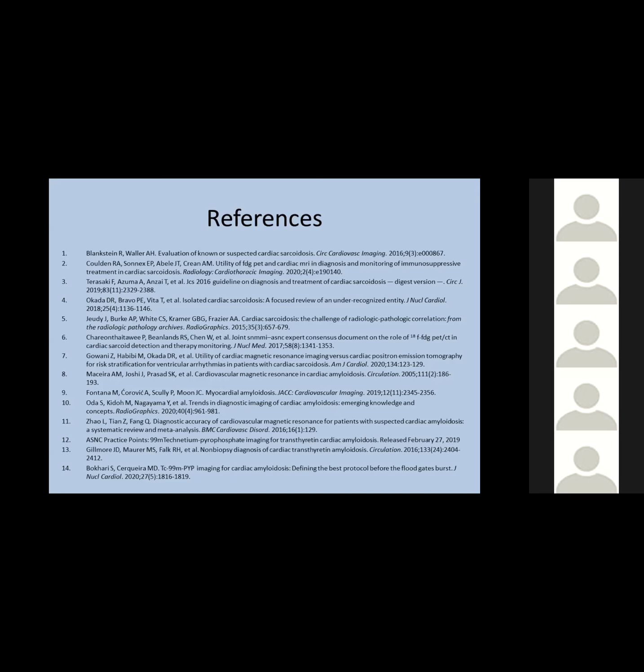Okay, yeah, so the first question, how accurate is MR once they have a pacemaker? Well, I find that ICDs and pacemakers don't really interfere much with our imaging, to be honest. The artifact from those is pretty minimal, and it's usually localized to the RV. It doesn't tend to interfere much with visualizing the myocardium. So I don't find it to be a major problem usually. I wouldn't wait to put an ICD in just for the purposes of MR, although I think there's a waiting period after.